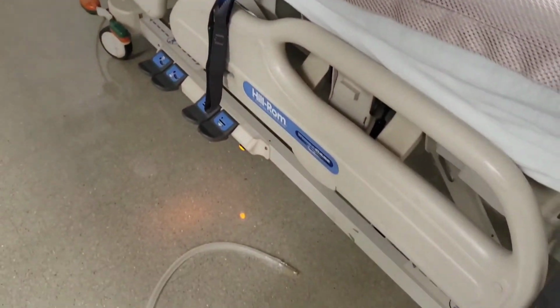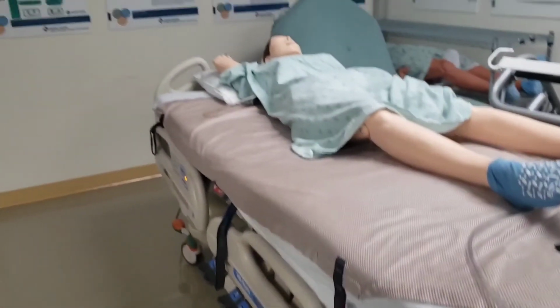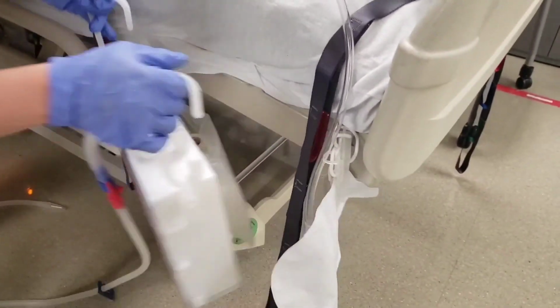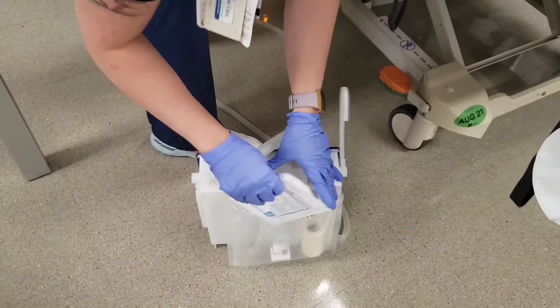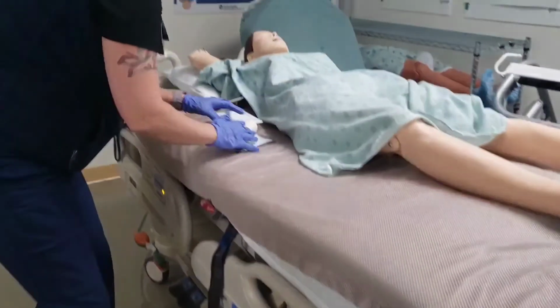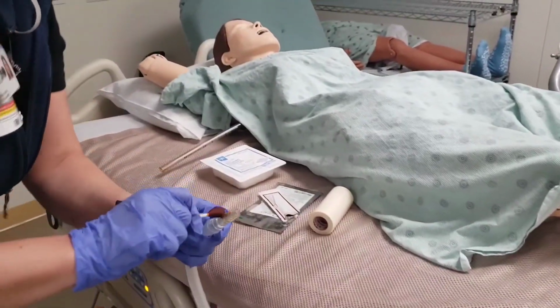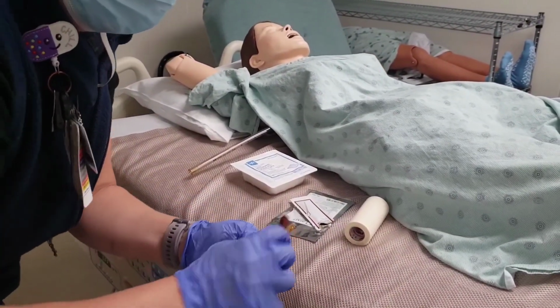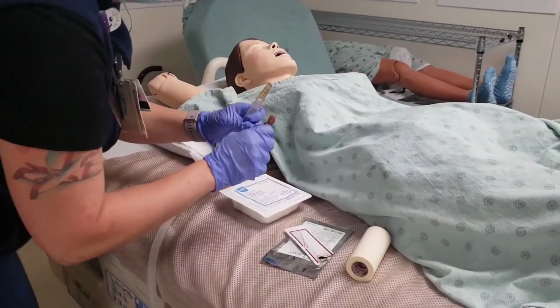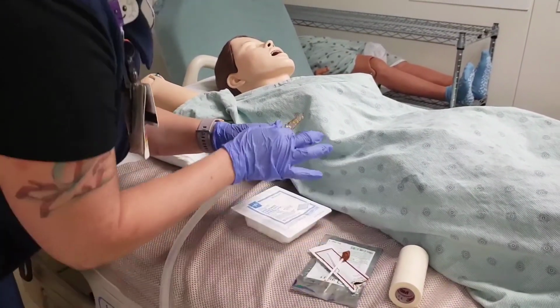If you find that the tubing has become disconnected from the chest tube itself, don't panic. Stay calm. We want to connect the 2 tubes back together as quickly as possible. We also need to make sure that it is clean before we connect it. It has been sitting on the floor. Use your iodine and clean both ends of the tube before reconnecting. After getting your tubing connected, assess your patient. It's recommended that you tape the 2 tubes together to avoid this from happening.